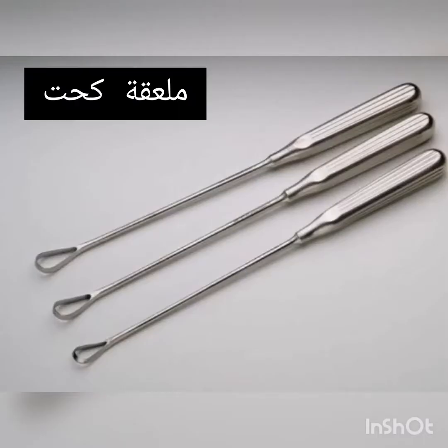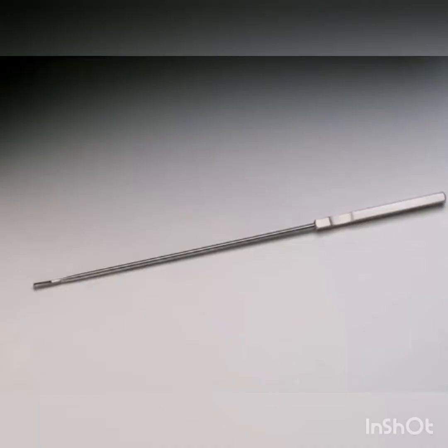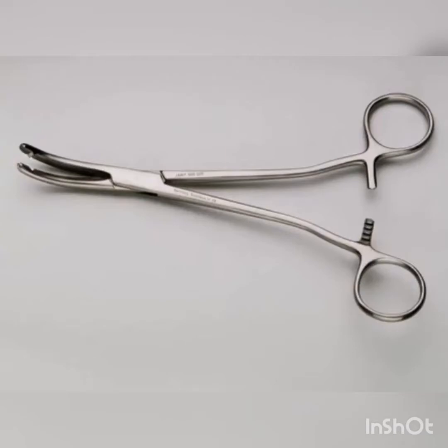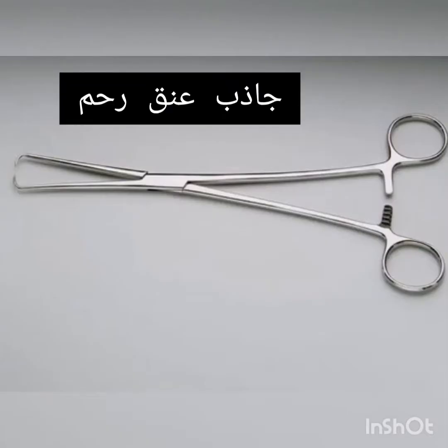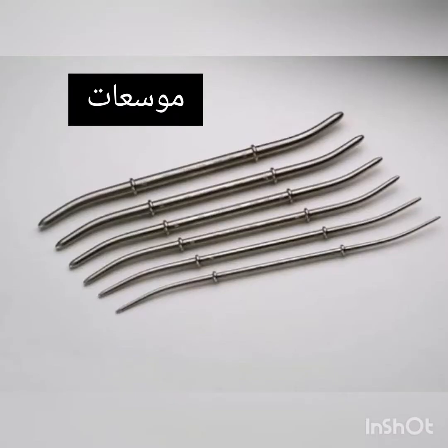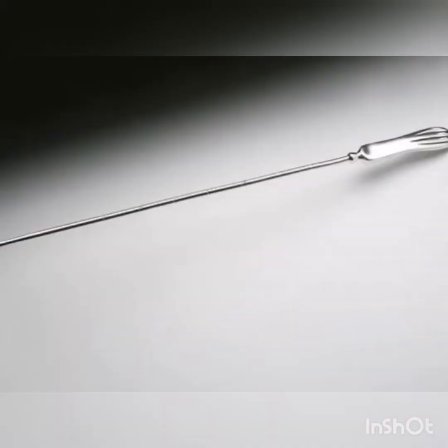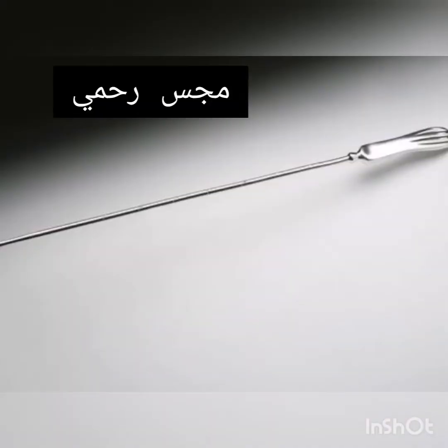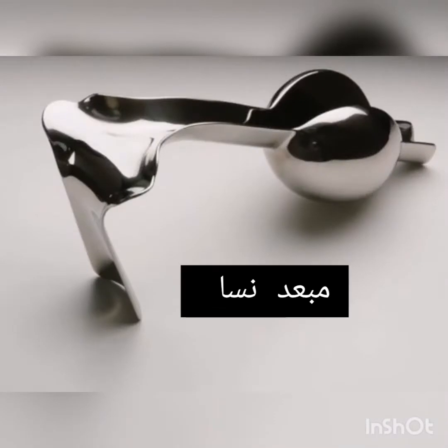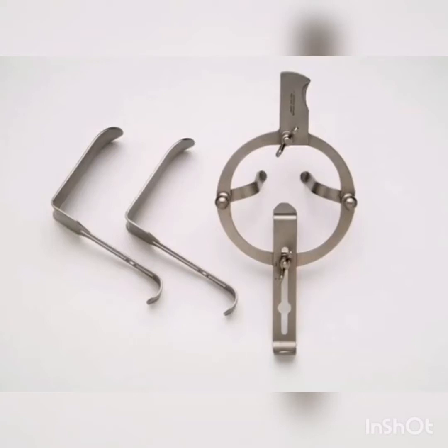Simms Uterine Curette. Kevorkian Endocervical Curette. Heaney-Ballantine Hysterectomy Forceps. Schroeder Tenaculum. Hanks Uterine Dilators. Hagar Uterine Dilators. Simms Uterine Sound. Auvard Weighted Vaginal Speculum. Graves Vaginal Speculum. O'Sullivan-O'Connor Retractor.